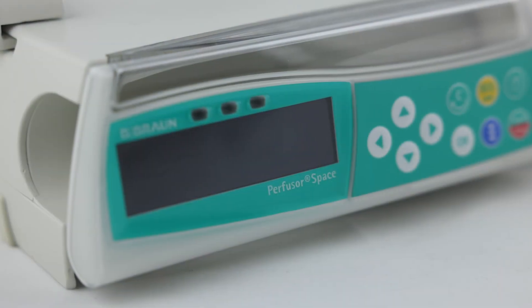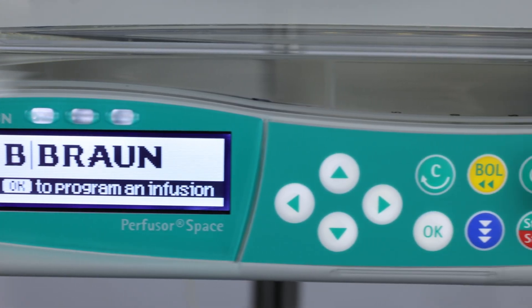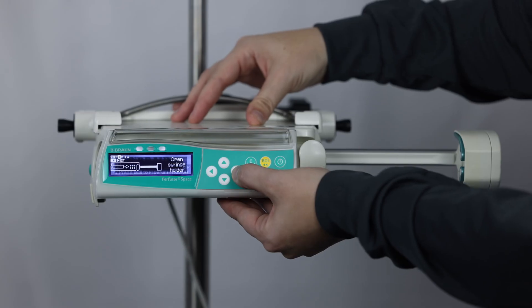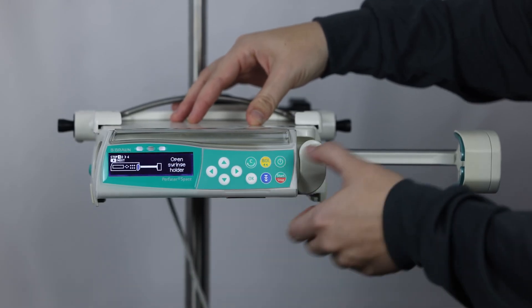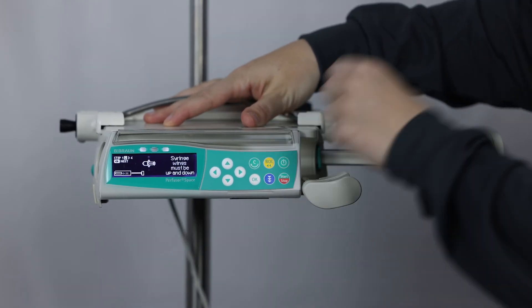The Perfuser Space syringe pump manufactured by B. Braun is intended for use on adults, pediatrics, and neonates for infusions or enteral nutrition. This is an excellent pump for transporting patients and is cleared by the FDA for both ground and air transport. It is small, lightweight, and is primarily used in hospitals.